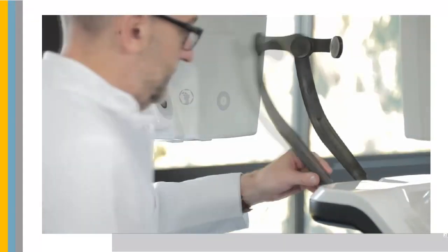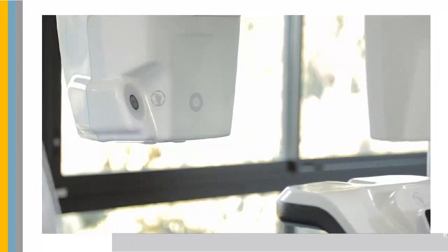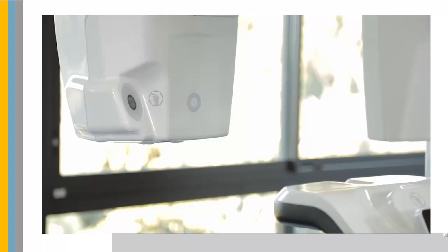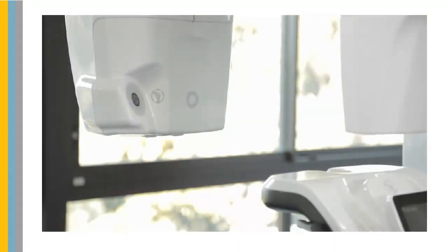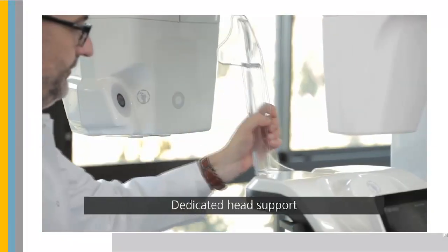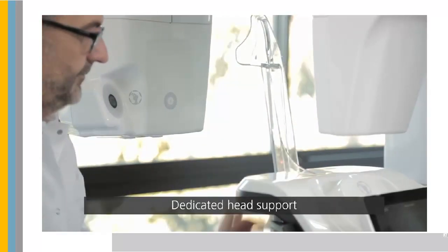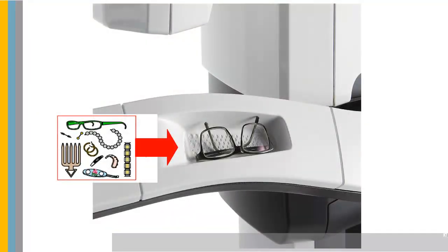Remove the temple supports by pushing in and twisting outward 90 degrees. Position the 3D Facial Scanner support. Make sure it clicks fully into place. Ask the patient to remove and place all metal objects in the jewelry tray.